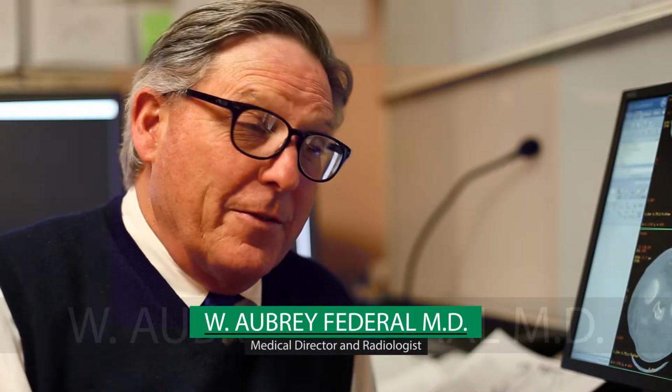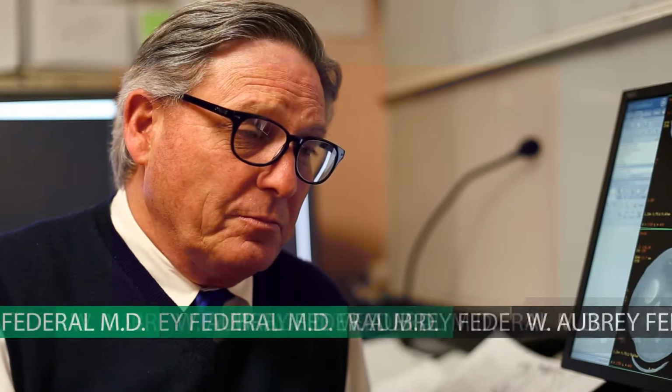Another area where 3D computed tomography is very helpful is with complex fractures. With X-ray you can see fractures, but you don't really know the full extent of them unless you get them in 3 dimensions and then take them apart in pieces. And then once you do this, the surgeon is going to be able to properly plan surgery when needed to put the bones back together close to their anatomical configuration in order to help reduce chances of complications and arthritis as the bone heals. I'm going to give you an example of that with a complicated fracture of the knee.